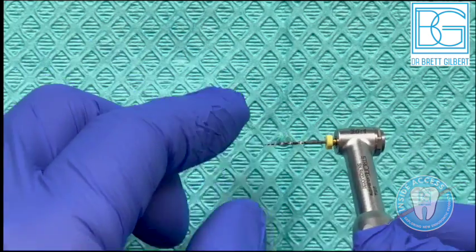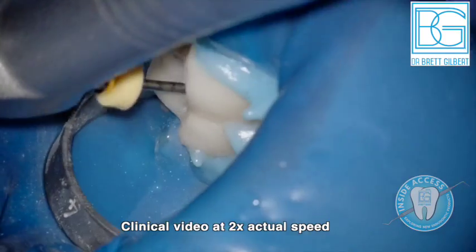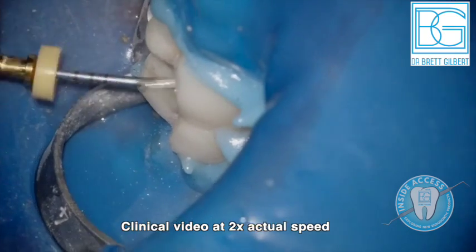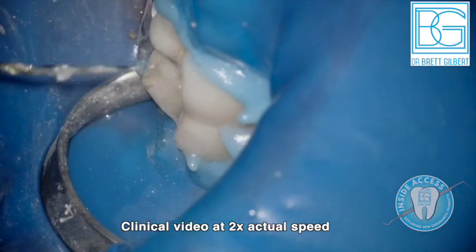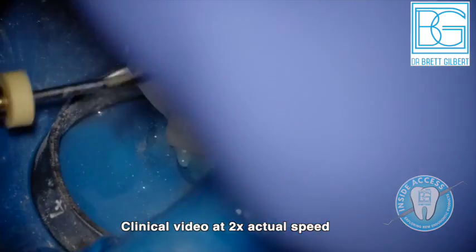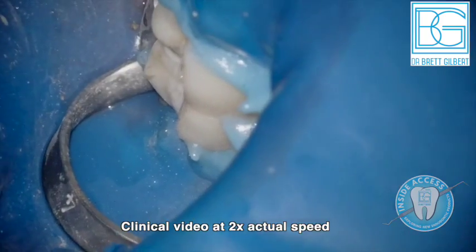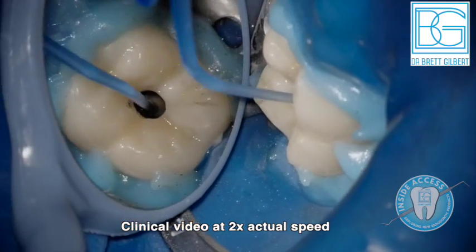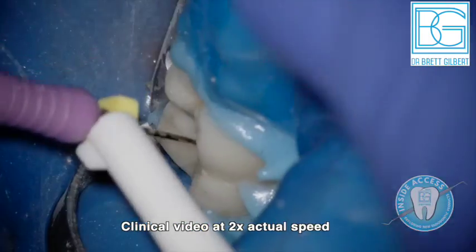Let's look at a clinical application. Here's the SX with nice controlled memory — this is your orifice shaper. At a slightly increased speed, it opens the orifice without needing to reach the stopper. This is a 17-millimeter file so you use whatever portion you need. You can see a withdrawal and re-engagement; ideally clean the flutes each time. Always irrigate once the orifice is shaped.